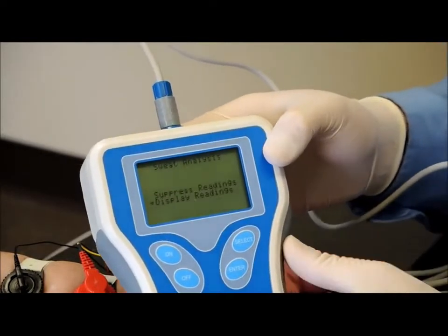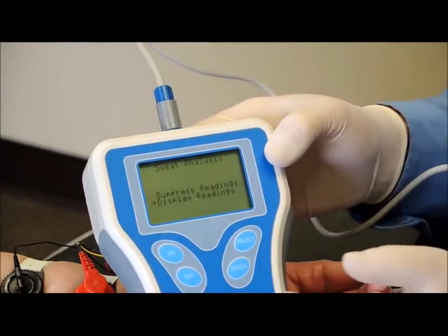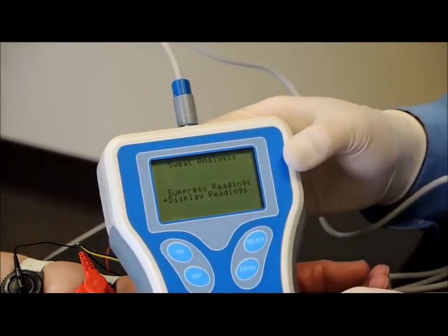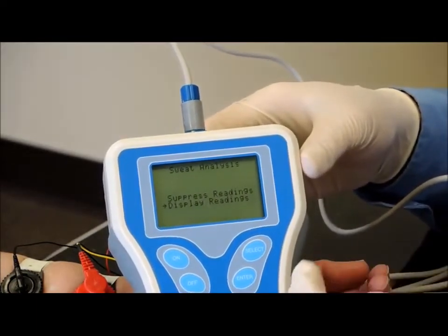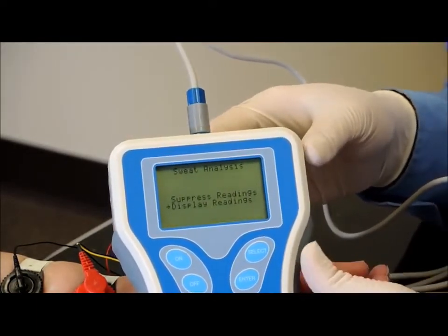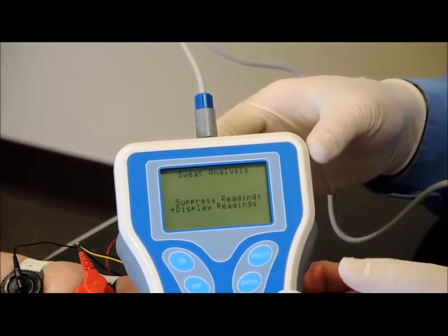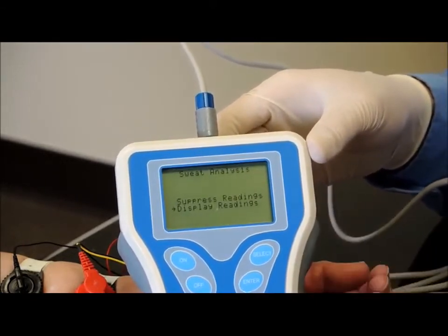You have the choice to display the reading or suppress the reading. In most clinical applications, you'll choose to suppress the reading. That will mean that there are no values being shown on the screen during the analysis. You don't have parents looking over the shoulder saying, "Oh, what's that? What does that reading mean?" If you're just doing a demonstration, you may choose to display the reading.